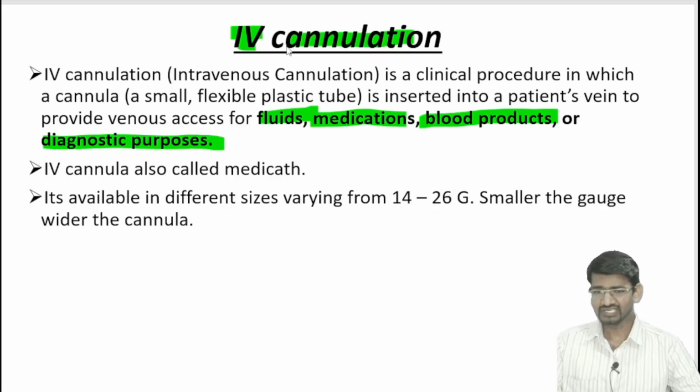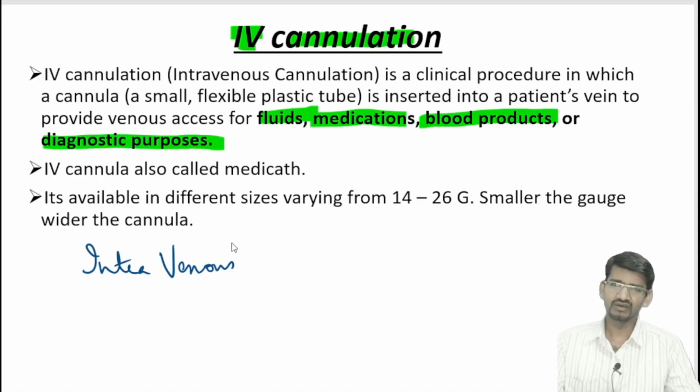As I told, IV stands for intravenous. Intra means within, and venous means the vein, so we insert a small flexible tube within the vein, which we call an IV cannula.